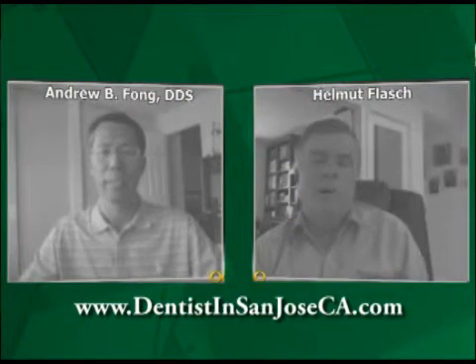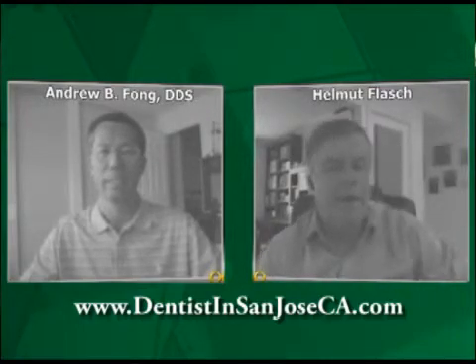I see. So basically, by suitable, I suppose you mean if the bones have shrunk already so much that your current denture is very loose, then it just might not be worth to put that on it. You better make a new one fitting the current situation and put it on.